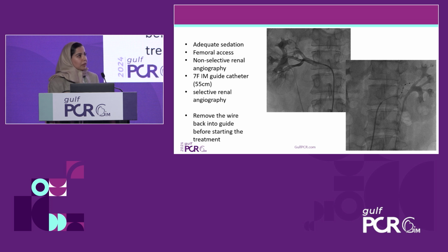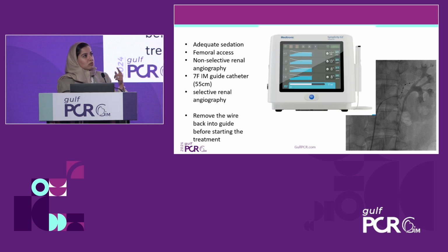radiofrequency ablation catheter. You take your selective images, you put your guide wire as deep as possible in the branches, as we talked about, and you start deep. One thing about the RF ablation catheter is that it comes with the 4 dots that you can see, and each dot is reflective of these 1, 2, 3, 4. You can go ahead and select one of them to be done if, in the setting that you're not happy with one ablation, it stops in the middle.